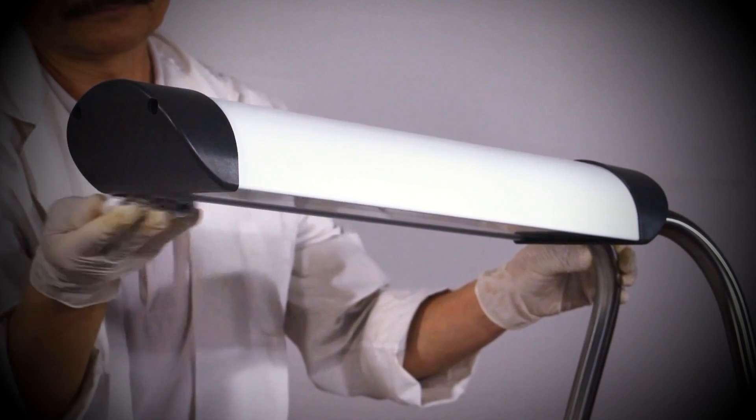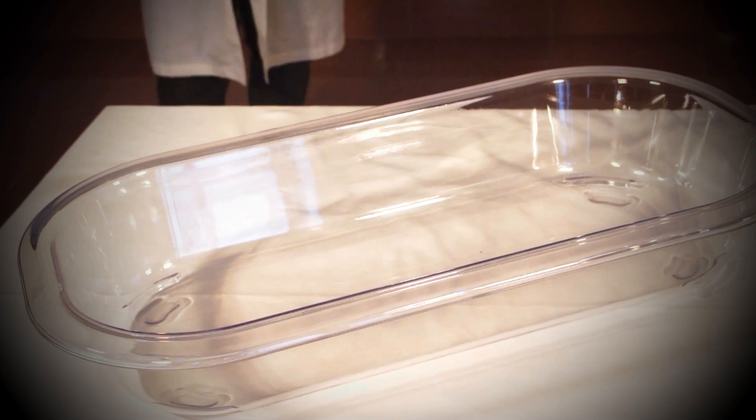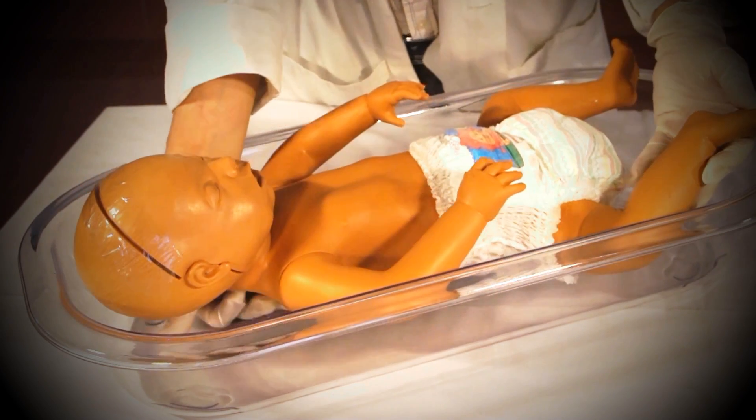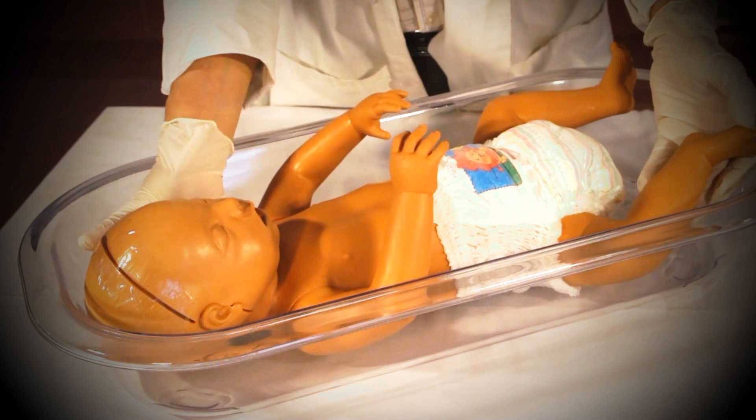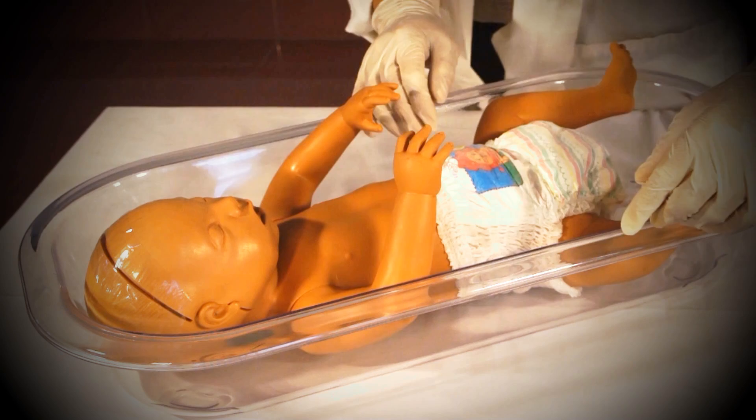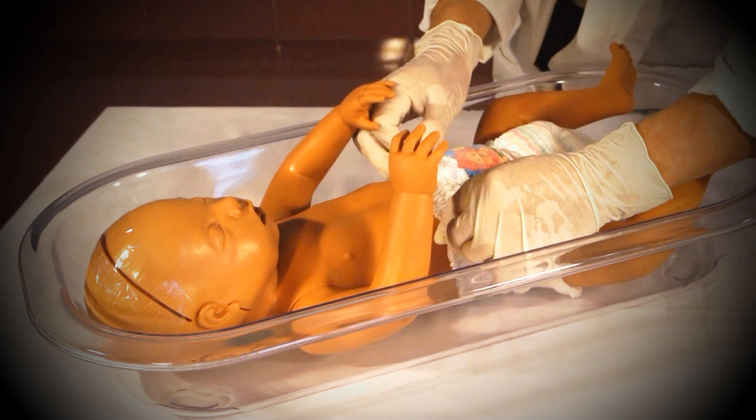Now the Firefly is ready for use. To begin, remove the bassinet from the main unit. You can now carefully place the baby into the bassinet. Do not attempt to place the baby into the bassinet or remove the baby from the bassinet while the bassinet is in place on the main unit.